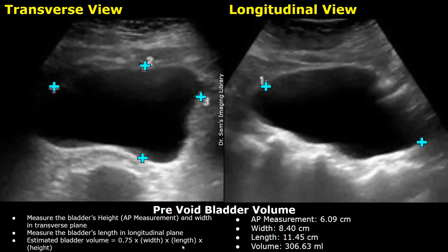In this example, the bladder's AP measurement was 6.09 centimeters, the width was 8.4 centimeters, and the length was 11.45 centimeters. This gave a volume of 306.63 milliliters. This is the pre-void bladder volume — the volume of the bladder before urination.